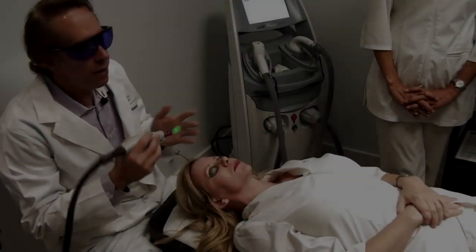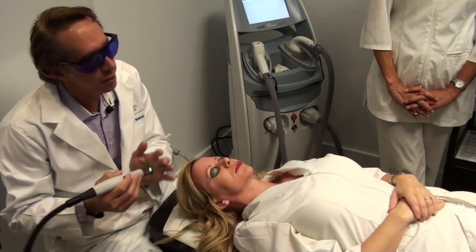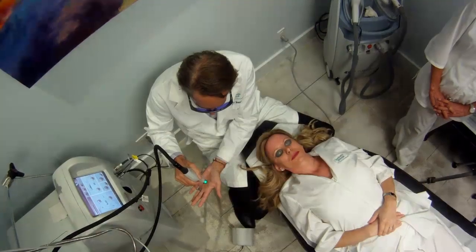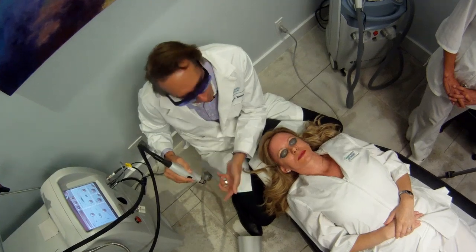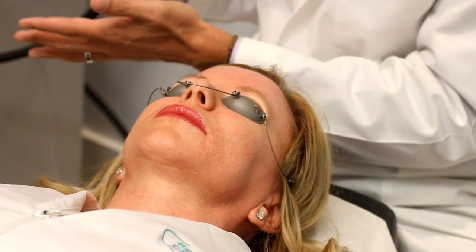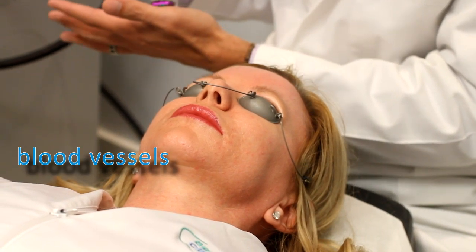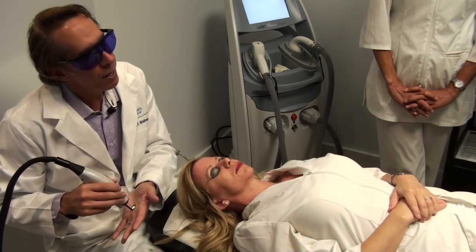What I have here is the V-beam, which is the pulse dye laser. It has an integrated cooling system, so when it fires, it fires out the cryogen at the same time that the laser fires. This is great for redness, rosacea, blood vessels, and some pigments.